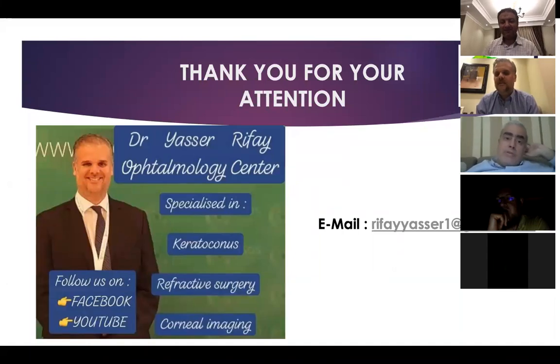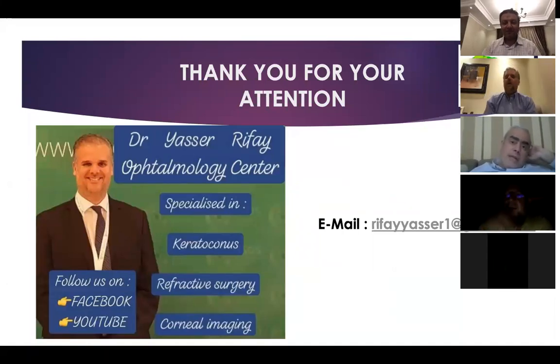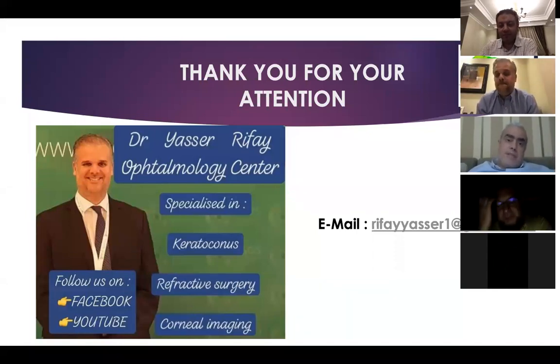I don't know. What do you think, Dr. Mazen? Would you do PRK in a case like this, even though Dr. Yasser has presented a very full defense of the epithelial mapping? What do you think?